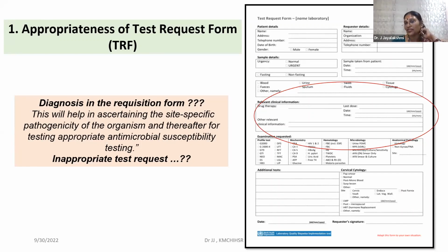There is a sample that reached my lab yesterday evening. There are five samples that have reached, with a single request. The technician, being a new person, received it because all of the samples are similar, but they are bottled separately. There are 5 samples put up. This is a synovial tissue that has been sent for culture.